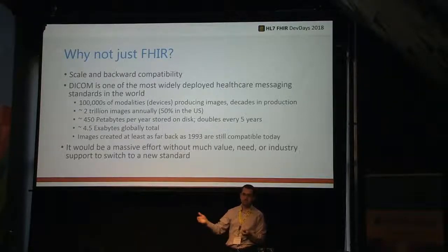Patients' records, images have to be accessible for pretty much a lifetime. Of course, there are more specific rules, but you could basically go back and crack open a DICOM file from 30 years ago, and it'll probably just open up just fine and display without an issue. The standard evolves, but it has to maintain some level of backwards compatibility. That's one of the reasons.